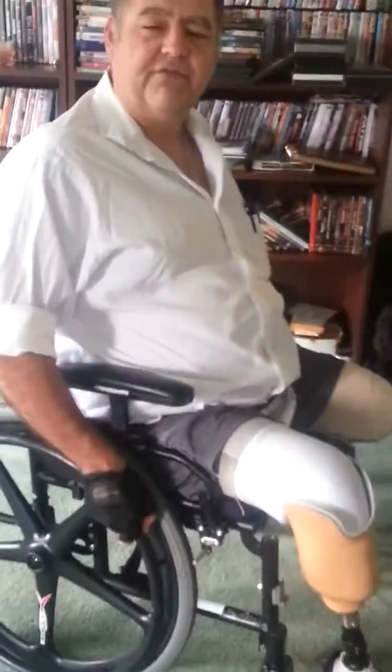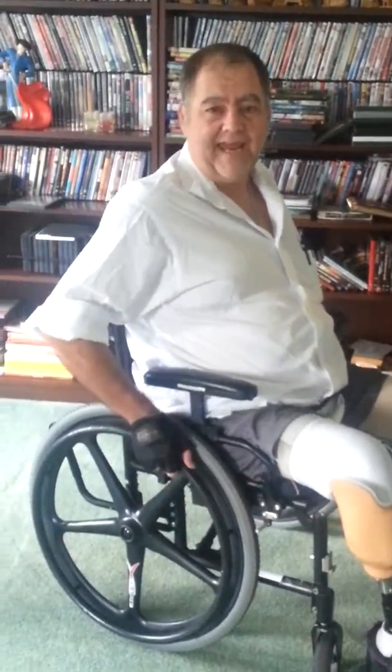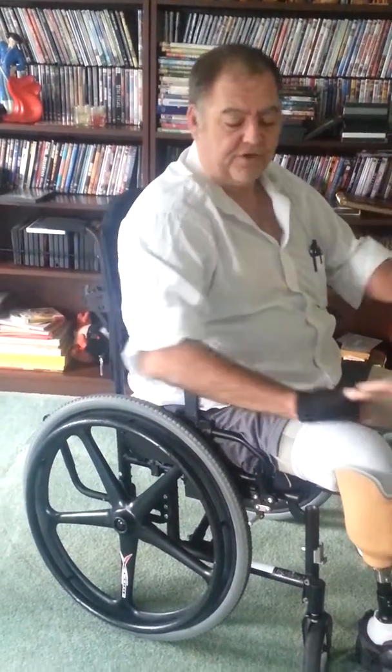It'd be very difficult to see, except that I do have one spot down here that's cut all the way through to the metal, as you can see. But this is pretty tore up all the way around. If I was outside putting a lot of weight, getting any speed, especially trying to stop, having those rough, splintery plastic things against my hands would be pretty doggone painful. So I think gloves are a super good idea.